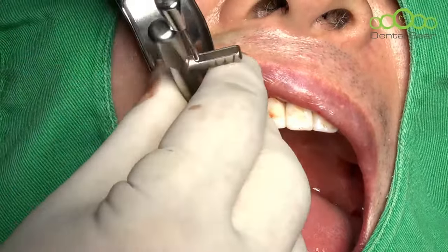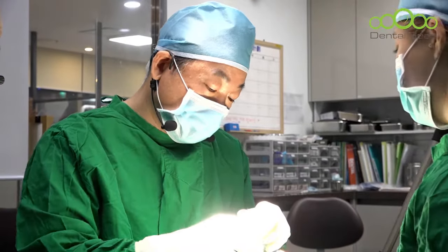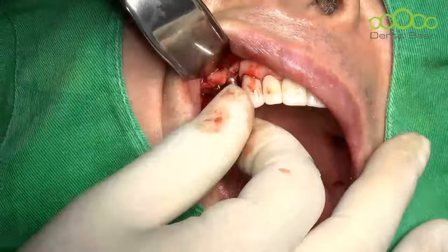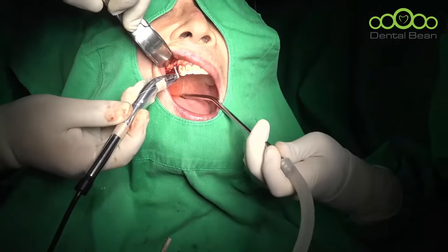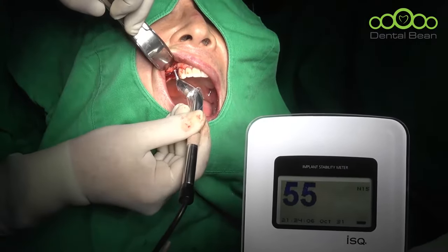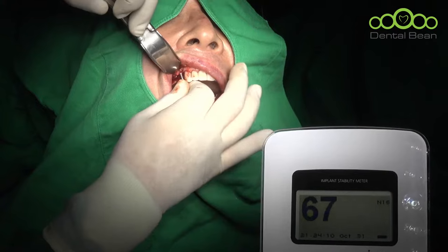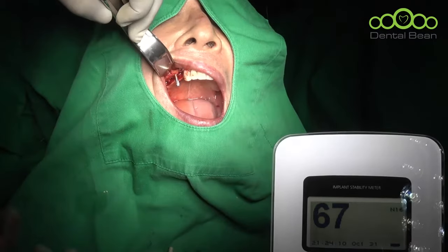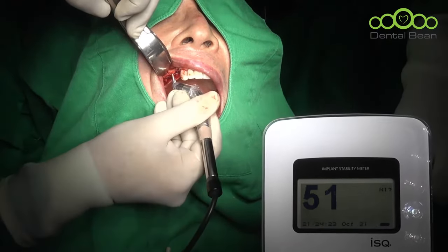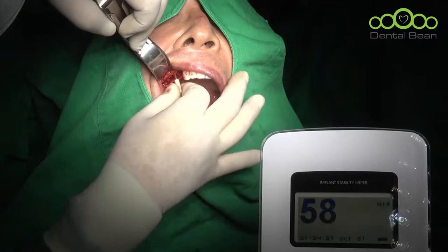Okay, let me check the ISQ value. Let me check. I'll check with the Osstell device. Okay. 55, weak. 67. That's not bad. However, it is not strong. And the second implant is not so strong also, maybe weak. 51, 55, should be submerged. How about number 6?